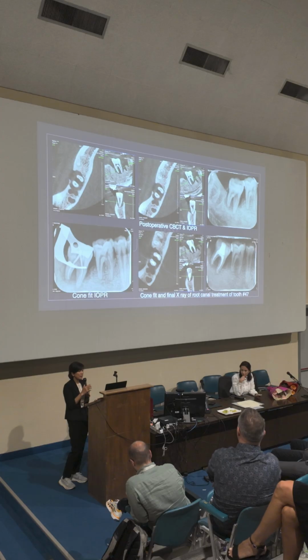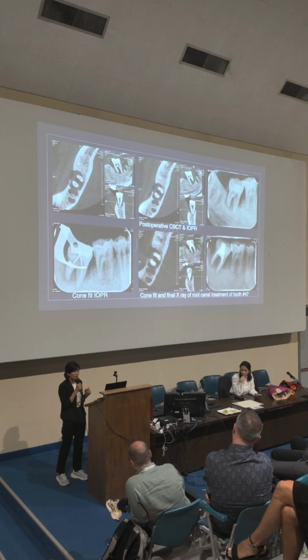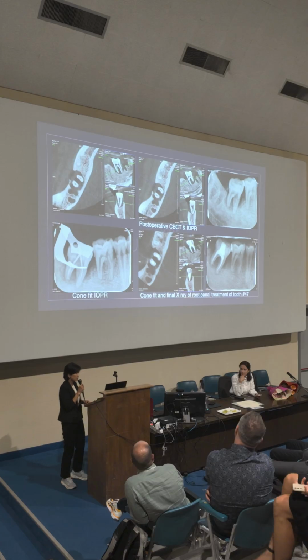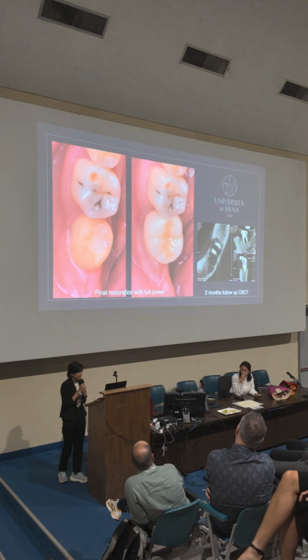And after 2 weeks, the fixation of the tooth is just by the suture, and the composite filling attached to the adjacent tooth. And after 2 weeks, I did the single visit root canal treatment followed by the full crown. And this is the 2 months follow-up CBCT.